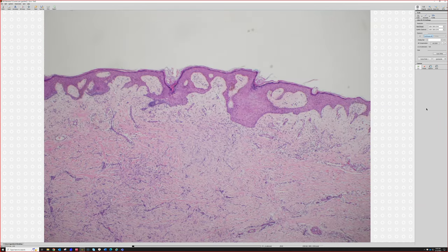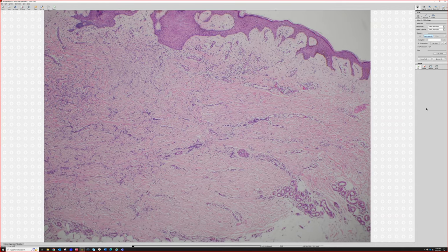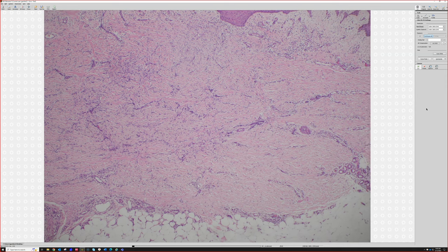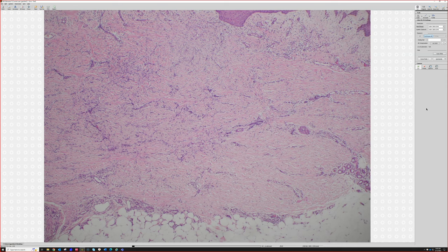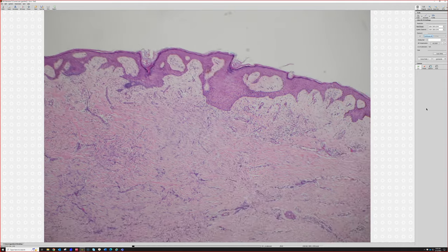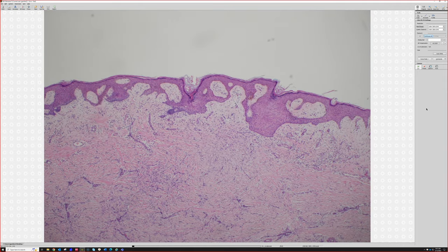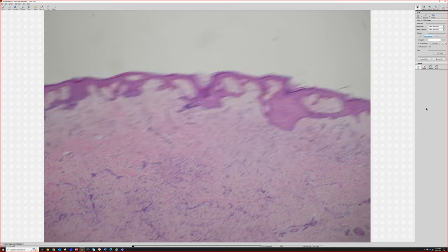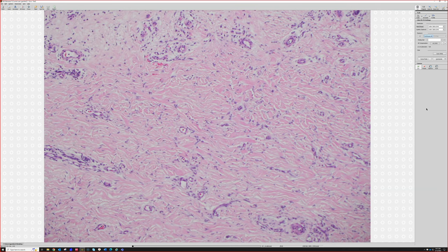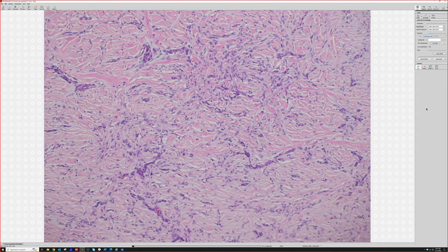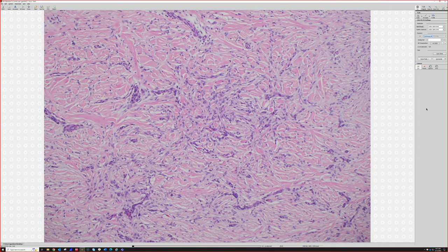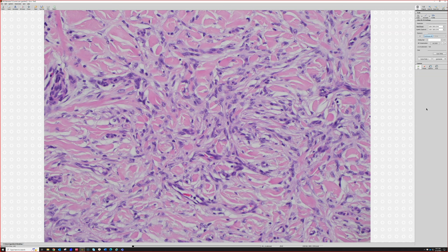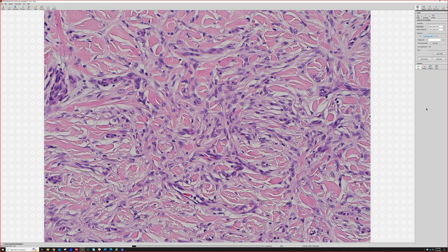Now look at the spindle cells here — this could be a little harder because there's really dense collagen, it looks almost scar-like. Some dermatofibromas are very sclerotic, some are kind of scar-like. The thing that helps me tell this is not scar, even from low power, is the epidermal change — scar usually has atrophy and loss of the rete ridges over top of it, whereas DF is the opposite. If you just had an area like this, I wouldn't be able to tell you that's dermatofibroma — it could be chronic lymphedema, sclerotic changes, stasis, or the edge of a scar. In the middle though, the spindle cells start looking more classic, and we've got entrapment of little pink collagen bundles wrapped around by the spindle cells.